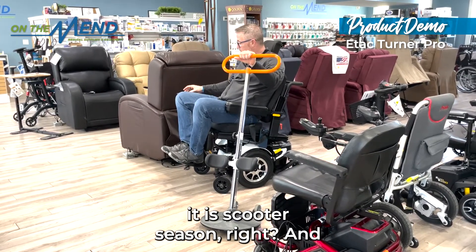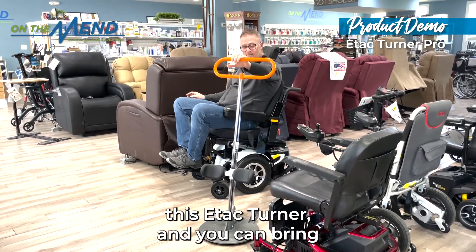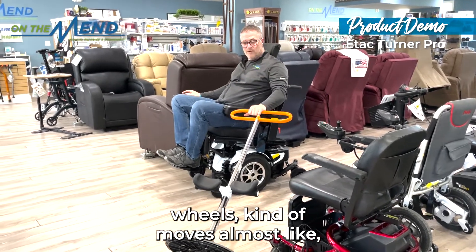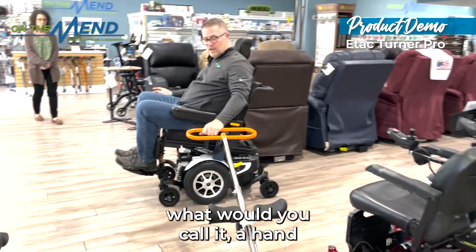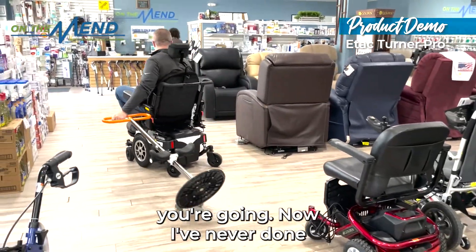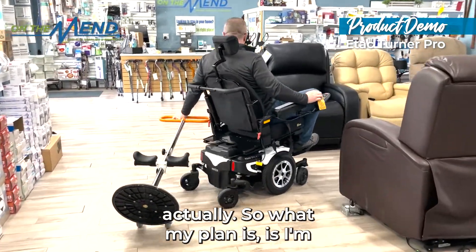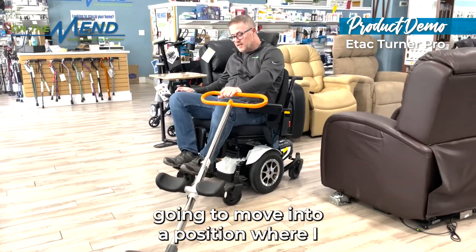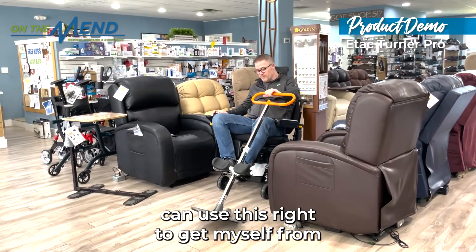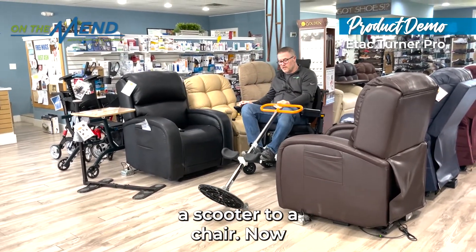If you're in a scooter — and it is scooter season — you can have this E-Tac Turner and bring it with you. It's on wheels, moves almost like a hand truck, so you can bring it to where you go. What my plan is, is to move into a position where I can use this to get myself from a scooter to a chair.